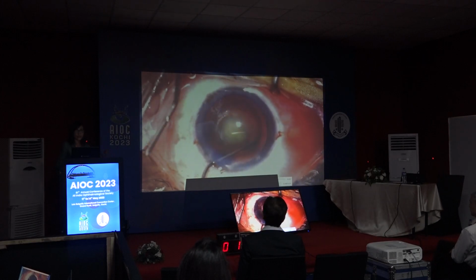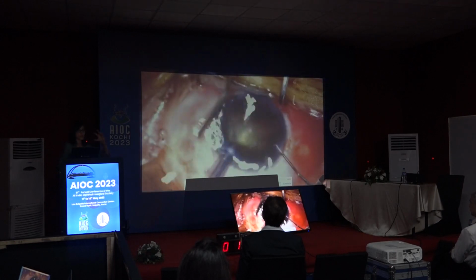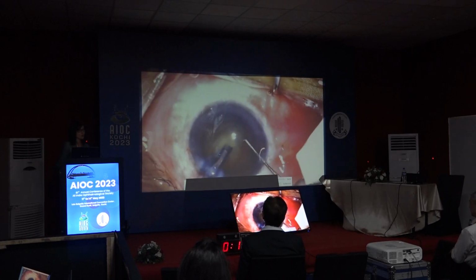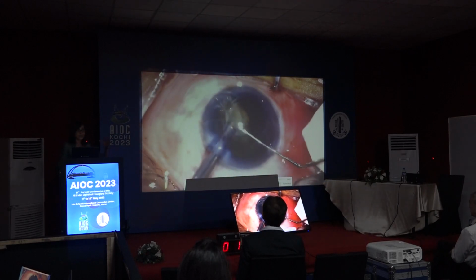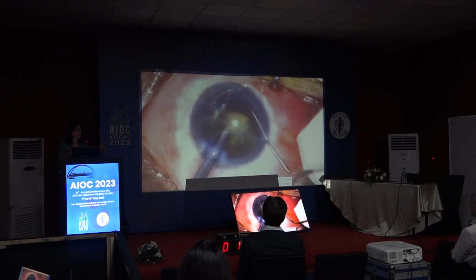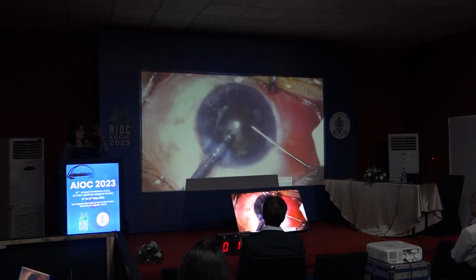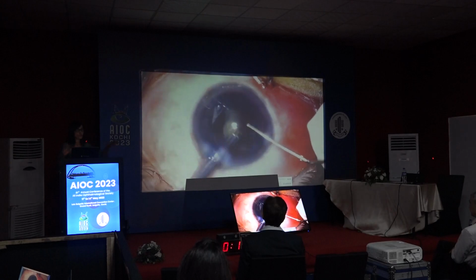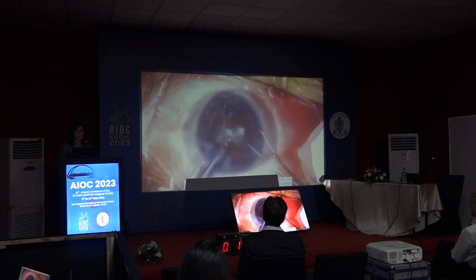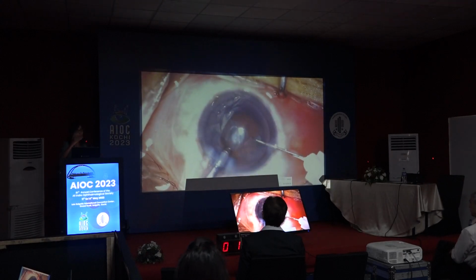And we never do a hydrodissection. You do a hydrodelineation, where you inject at a particular depth to create a particular size of an endonucleus. Minimum manipulations during phacoemulsification. I like, if the cataract is soft, to impale into it, bring it up so that all the manipulations thereafter are above the area of the rhexis. In that manner, I'm able to facilitate minimum exertion of forces within the capsular bag that could compromise my posterior capsule.